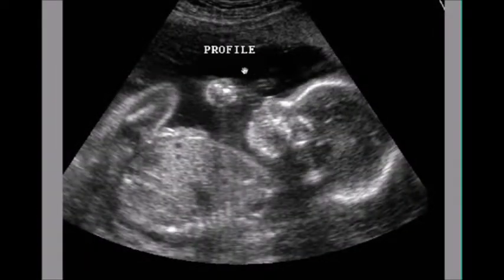So this is our first ultrasound image. Again, just imagine the dot right over here on the left side. We're scanning with the dot pointing up. So this is the up. You can see that the baby's head is down. So this is a vertex presentation, and the birth canal is right over here on this side because this is down. So this is what we want to see, where the baby's head is on the right side of the screen. So this is baby, head is down.